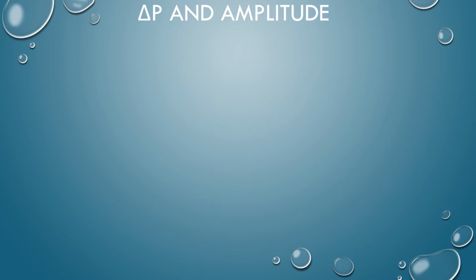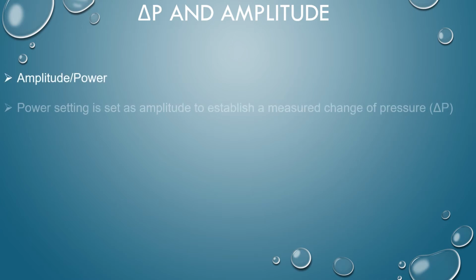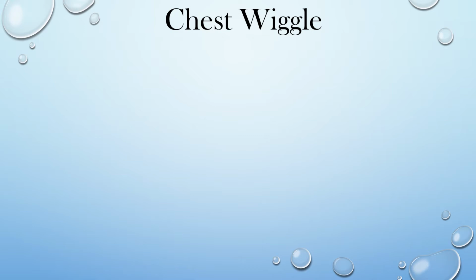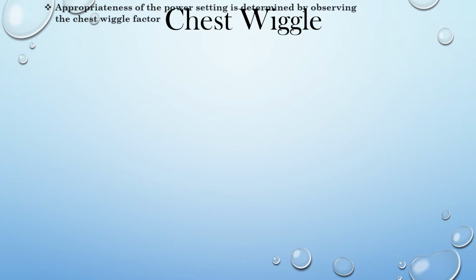Delta P and amplitude. Amplitude and power. Power setting is set as amplitude to establish a measured change in pressure. Delta P determines the amount of power that is driving the oscillator piston forward and backward, resulting in an air volume, tidal volume, displacement. Appropriateness of the power setting is determined by observing the chest wiggle factor.